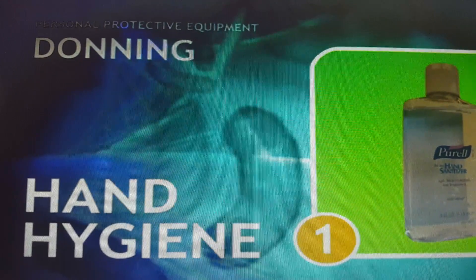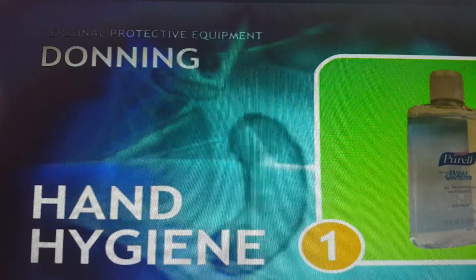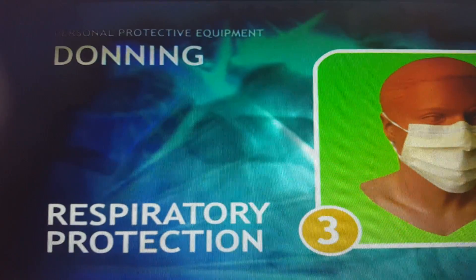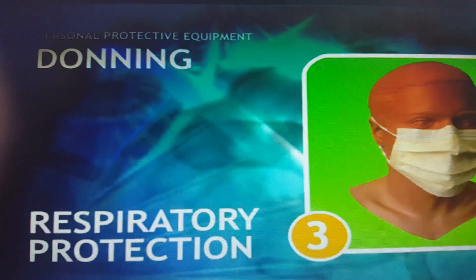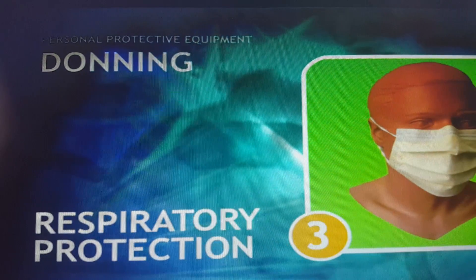First, you have to do hand hygiene with the correct sequence — the six steps of hand hygiene. Then you have to wear the gown. Then respiratory protection, which will be a mask — either a surgical mask or N95 according to the diagnosis and the disease you are dealing with.